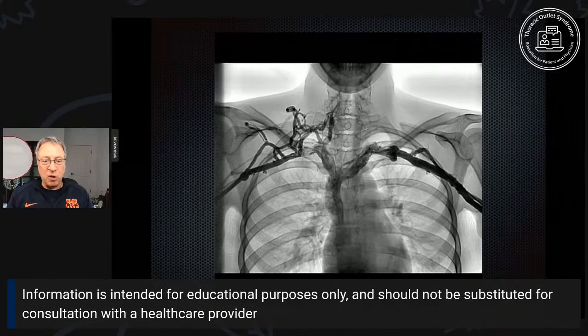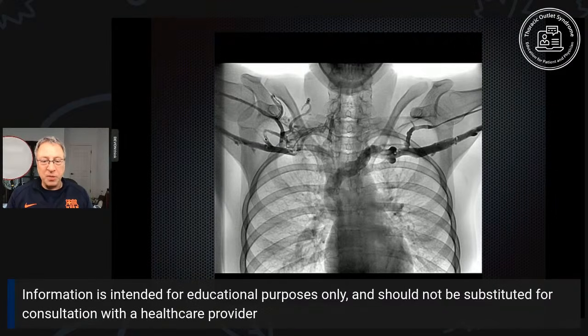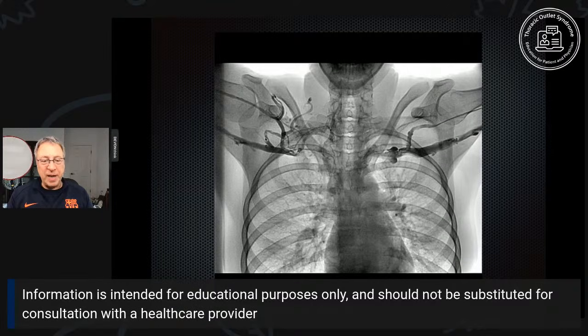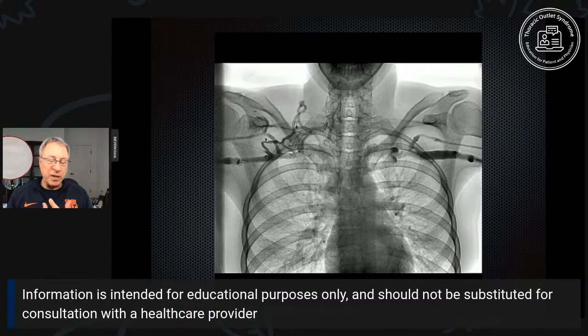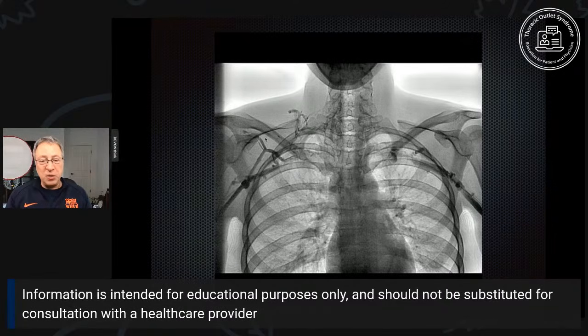You can see on the right there's a whole bunch of extra veins because when the patient raises their arms, there's compression. You can't see anything coming through that vein that's on your left or the patient's right. So this is pretty neat. We don't see these too often because in this country we have other tests. But Dr. Gamboa showed me this, and this is the test that they have to use. It's really kind of a cool picture for me.